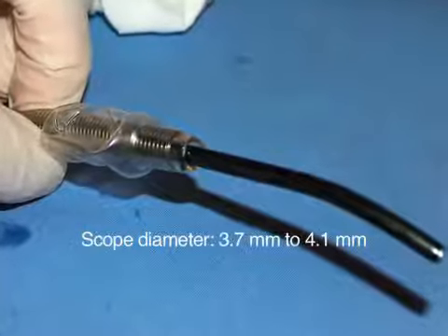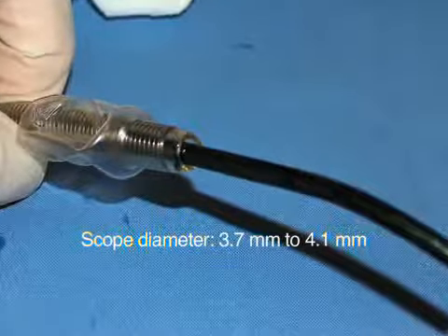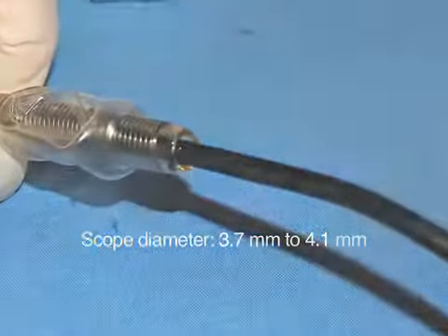The diameter of the flexible fiberscope should be between 3.7 and 4.1 millimeters.